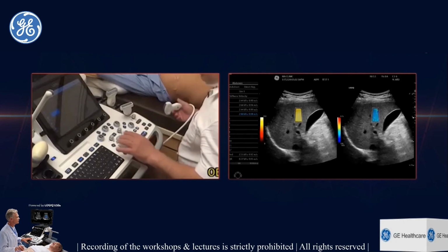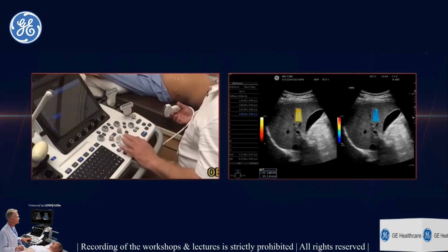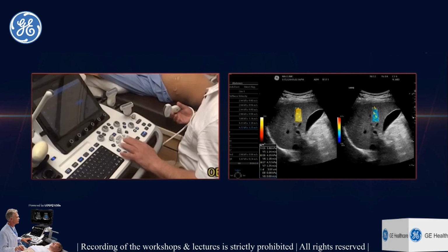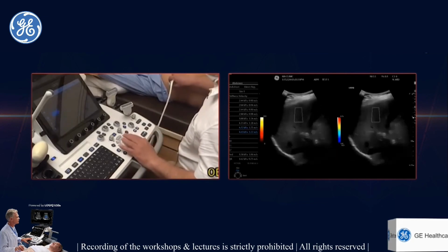Now that's a perfect match, a perfect map. And we can see that we got a uniform yellow, uniform blue, but now there's one problem here. In the extreme top of the image, we can see that the circle is red. Now, this is another check that the machine has, that if there is a red circle coming, that means that ROI needs to be rejected. The yellow ROI is good. So although it's confirming the normal measurements, it's one of the quality checks that is again there.